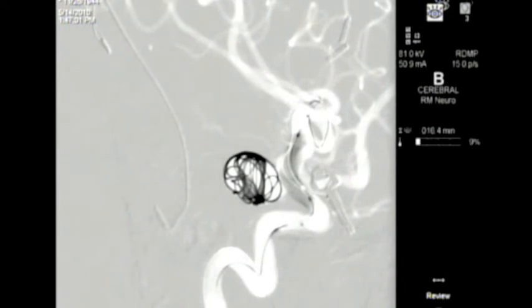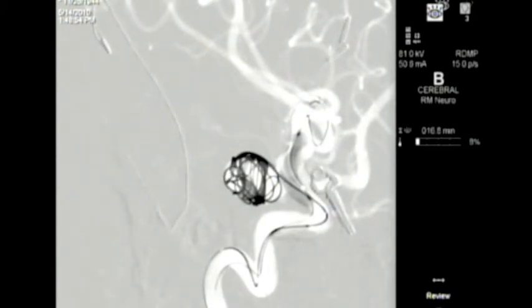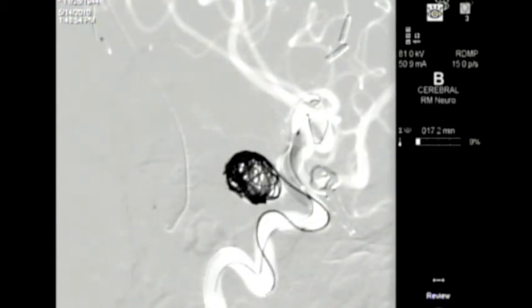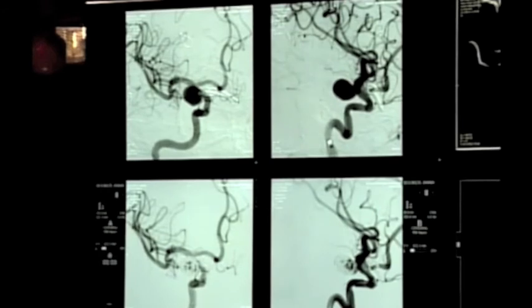You can see the end of the first coil going in right now. Again, the aneurysm is being sealed off from the normal artery using the balloon that's inflated across its neck. Here you can see a second platinum coil coming in through the microcatheter and being delivered into the aneurysm. There is still some residual filling within the aneurysm.